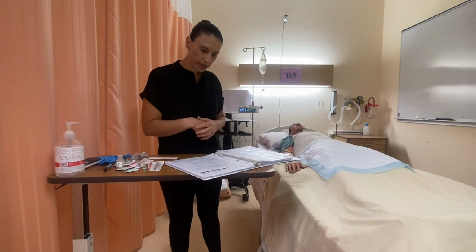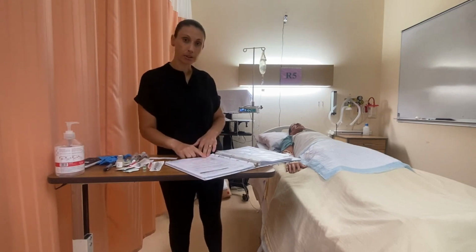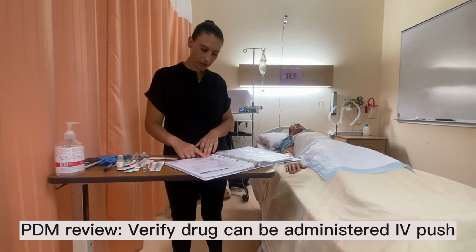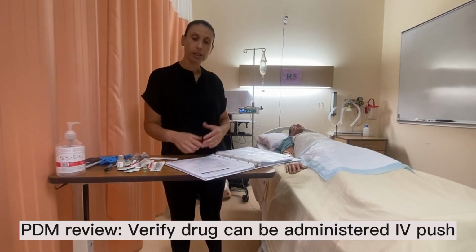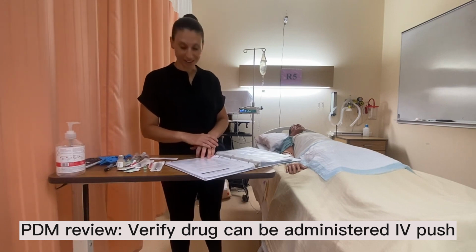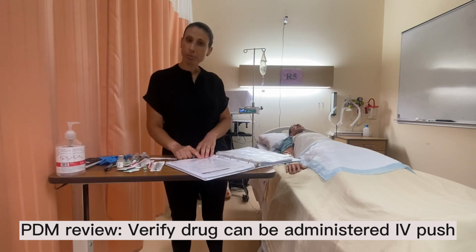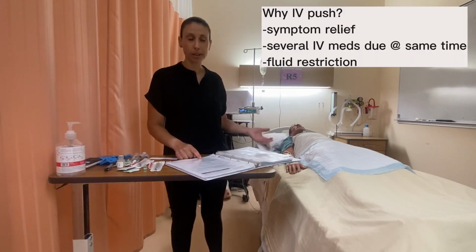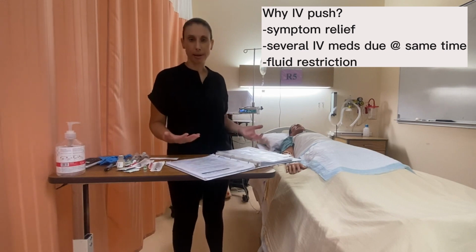So we'll read all the administration policy there, and we'll also skip down to make sure that we can give this medication IV push. Some medications you cannot give IV push because it's too potent. It needs to be diluted, and then it can only be given IV intermittent. You would make a piggyback. So for morphine, we're going to give it IV push because the patient is having a lot of pain. We want the medication to be delivered quickly so that they can be relieved of their pain.